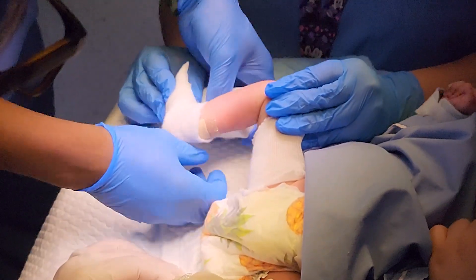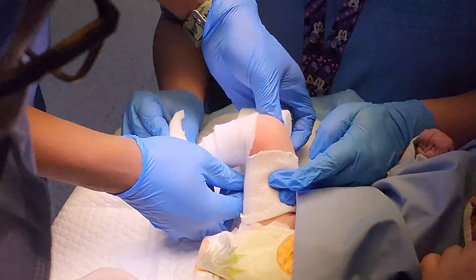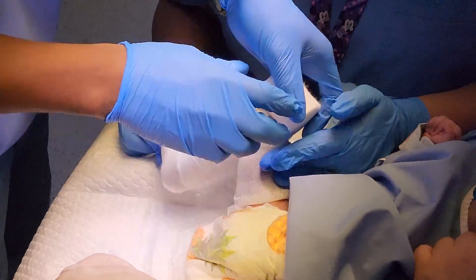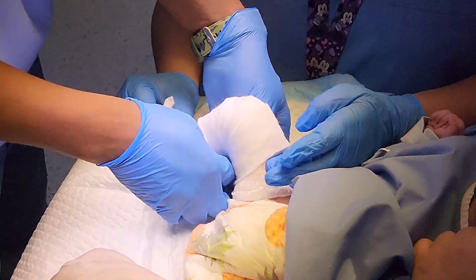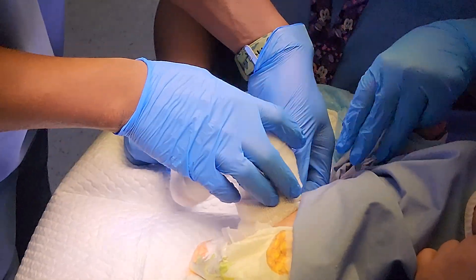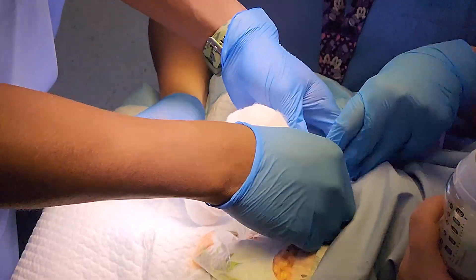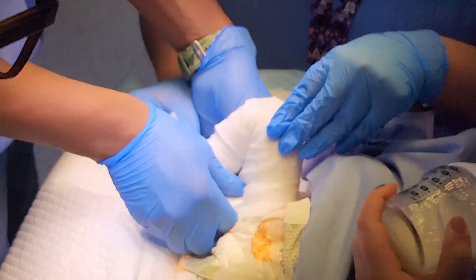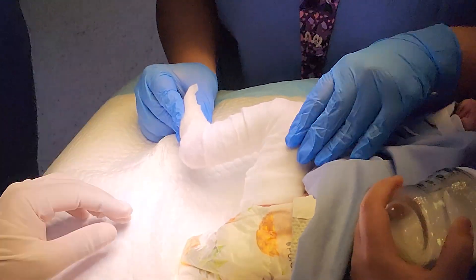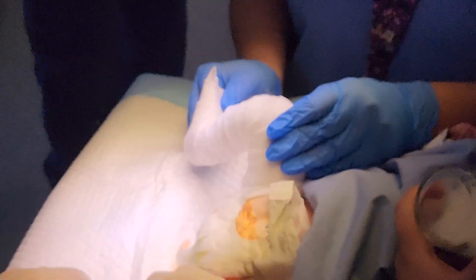This is the final set of casts for this child, and it will usually stay for three weeks, after which we apply the boot and bar. We put a stockinette around the thigh, folding it later to give a nice finish to the cast. For the same reason, we go as high as possible with the soft roll and fold it back to give a nice soft finish at the top.